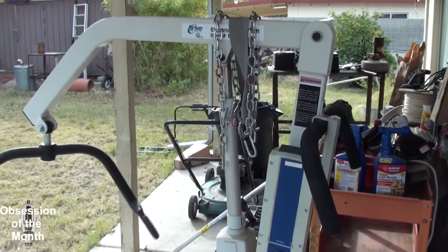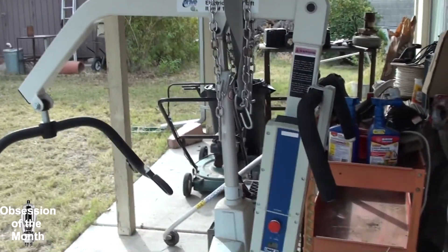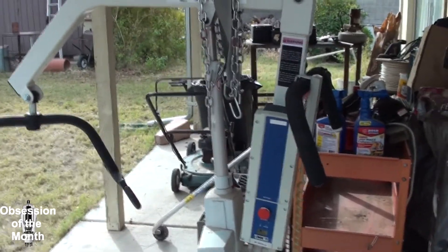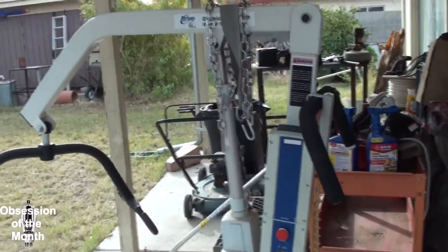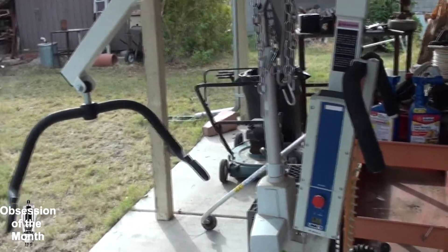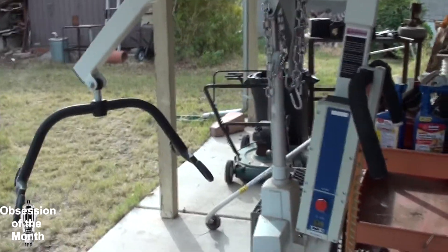This is a Hoyer lift — that's the generic term, which comes from the name of the manufacturer. This one is actually made by Linac. It's used for picking up people who cannot get up themselves. This one can handle about 600 pounds.